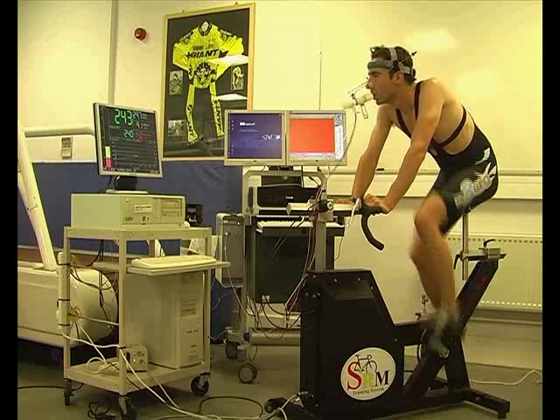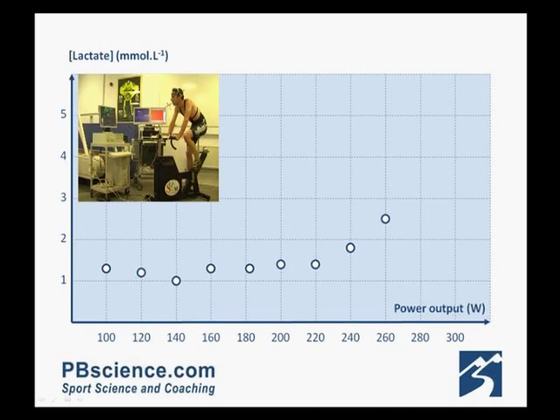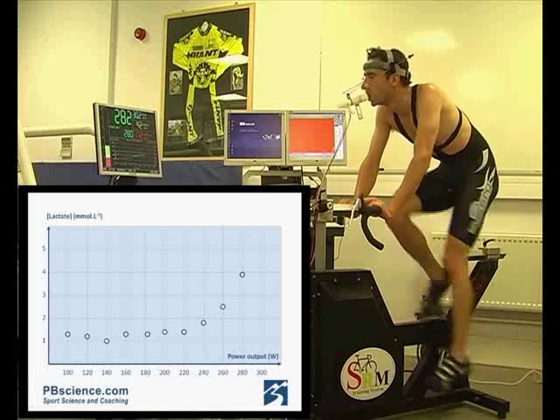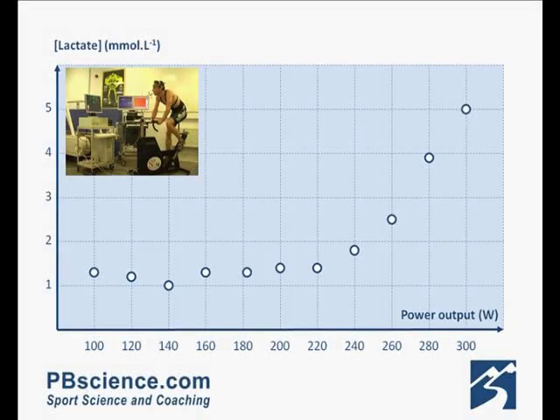By the time our cyclist reaches 240 watts, his blood lactate concentration has just risen above baseline. Only slightly, but you can just see it, just starting to turn up at 1.8 millimolar. By 260 watts, the blood lactate concentration is really starting to show a rise, 2.5 millimolar now. At 280 watts, and 3.9 millimolar, it looks like the blood lactate profile is growing even steeper. We're now in the stage at 300 watts, and as you can see, the blood lactate concentration has risen to 5 millimolar.